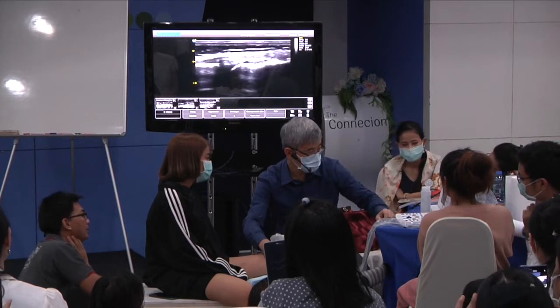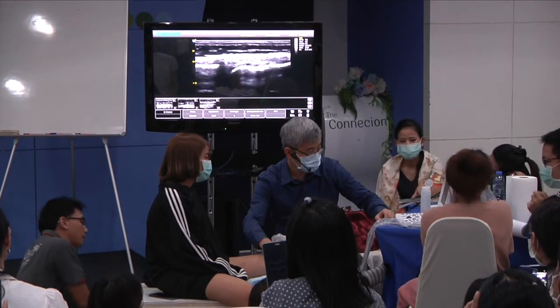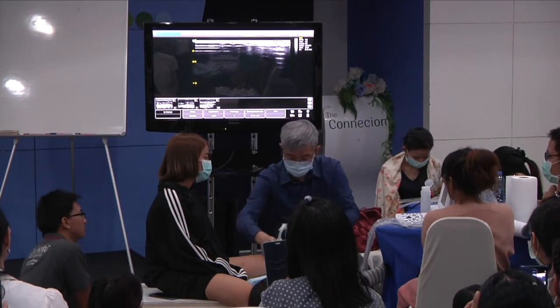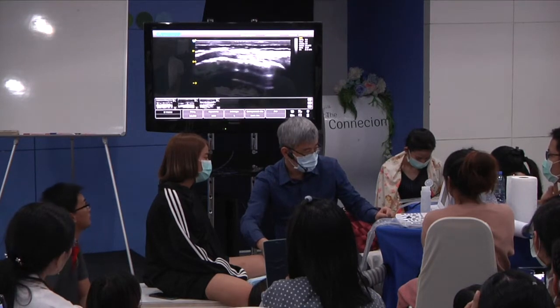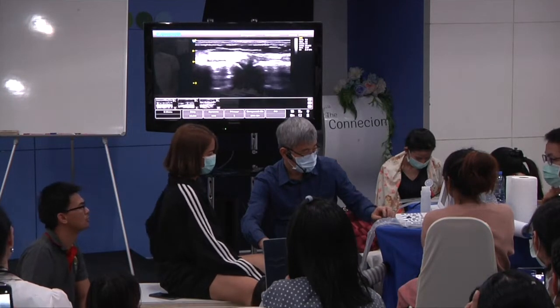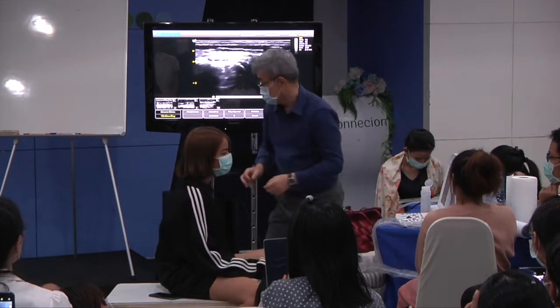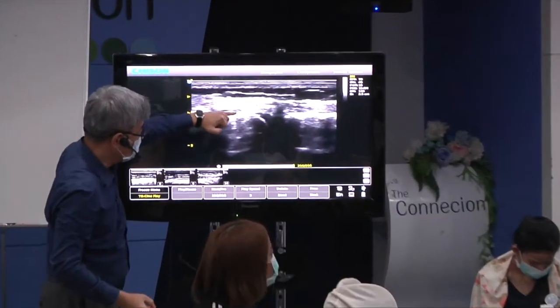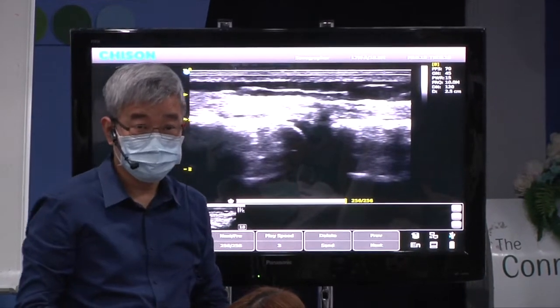The focus is all right. Now I'm going to use heel lifting. Thank you. Heart shape, deep, superficial, go, go, go. Easy for me.